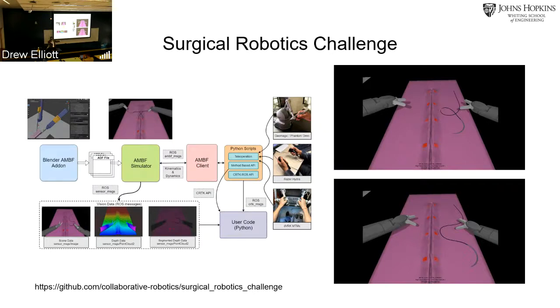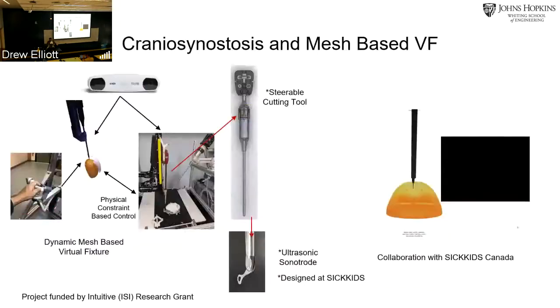That's in fact something that we want to try very soon, even with this project that I showed here. I'm not showing the scalp on top of the skull, but we intend to make a soft tissue of that scalp, so that when you put your tool, you can actually see it deforming and go through that. So that's something that we are hoping to get into very soon.